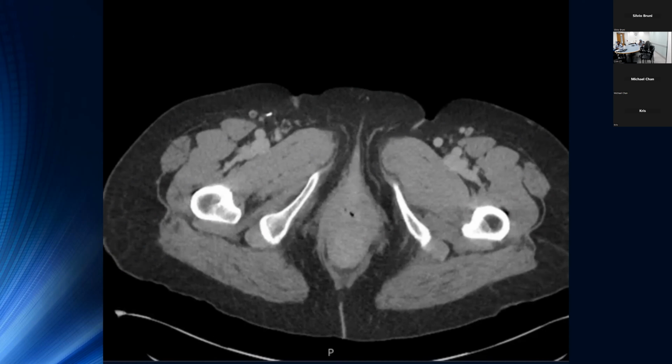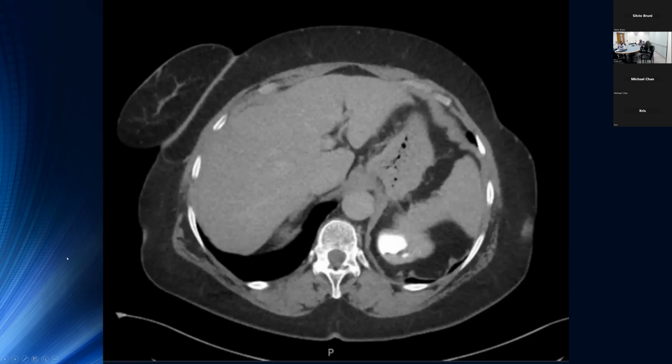The main difference is that the renal collecting system is not dilated. You're not getting layering contrast. It's just that you have these segments where the ureter has spasm or has peristalsed, and you're just not getting opacification through that segment. But often you'll see contrast beyond that level, and really the ureter is not dilated, the renal collecting system is not dilated. There's no layering of contrast. So that alone is not a reason to repeat, but in this case, we have that dilated ureter with that layering contrast. That's a good reason to repeat with the prone.